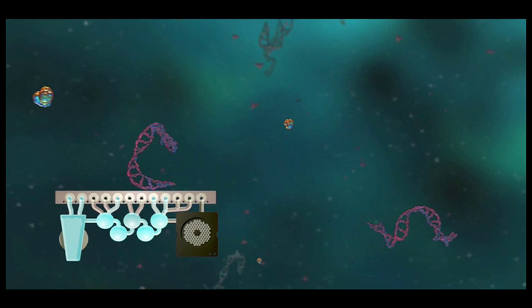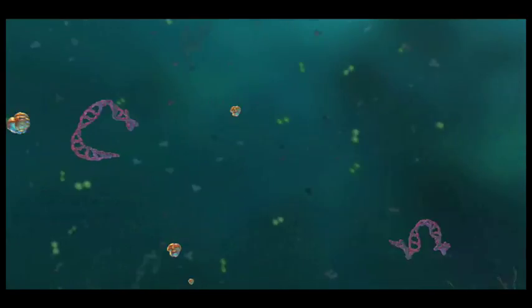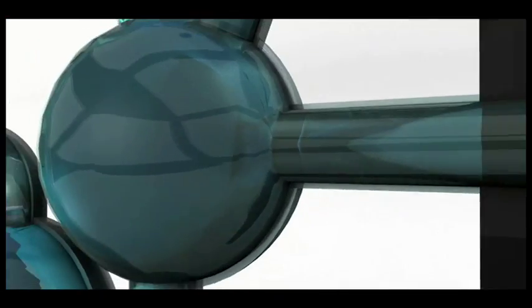Next, the diluted first stage PCR products are combined with a fresh master mix and then aliquoted to each well in the array.